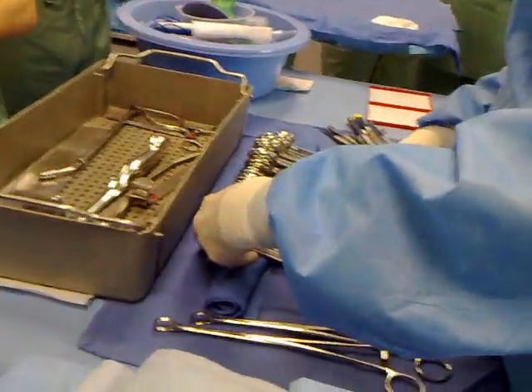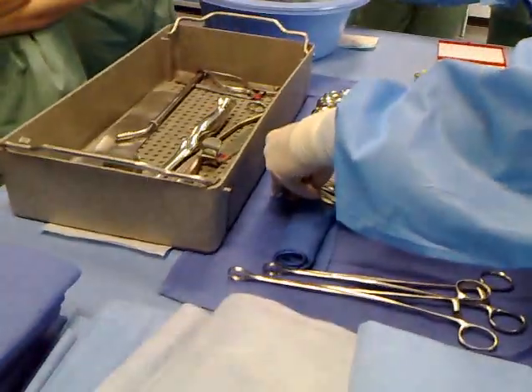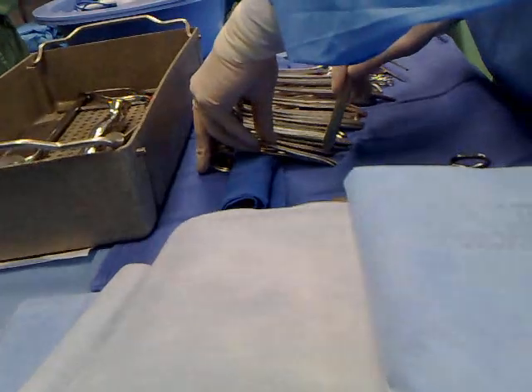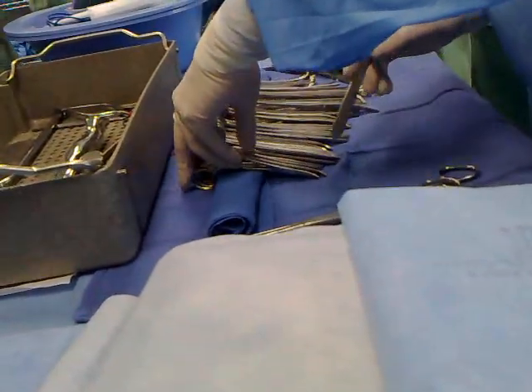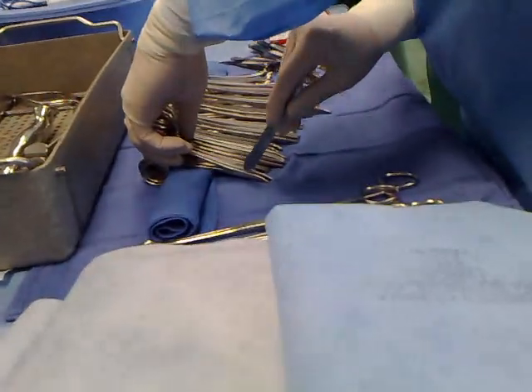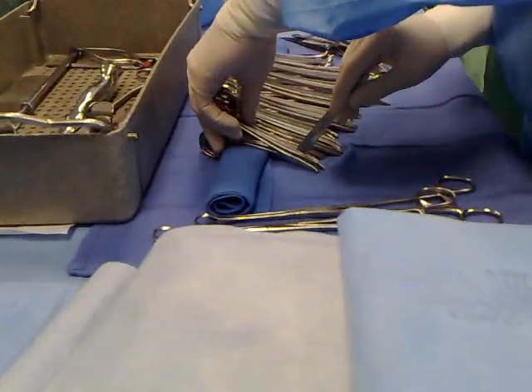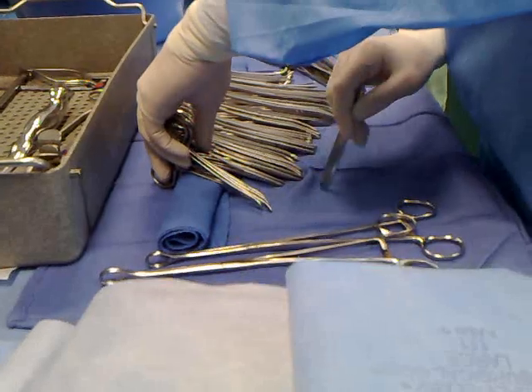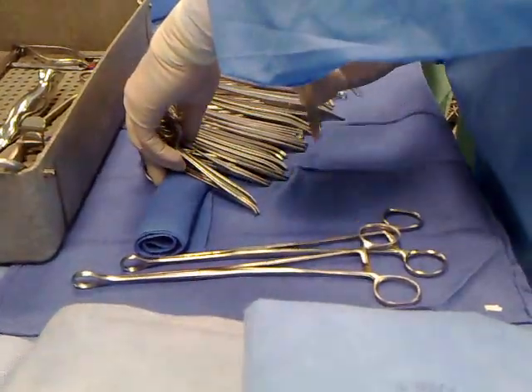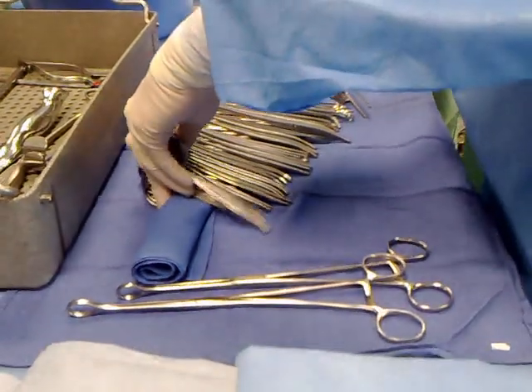This is where it becomes very important for you to have the set put up properly. If they didn't get it in the correct order — for example, they changed one of the straight mosquitoes — you'll need to correct it. Some places require you to count one, two, three, four; other places allow you to count two, four. Do what your place does.